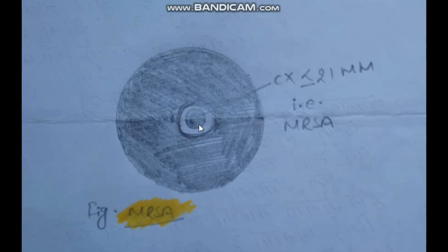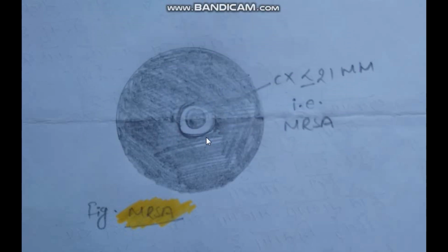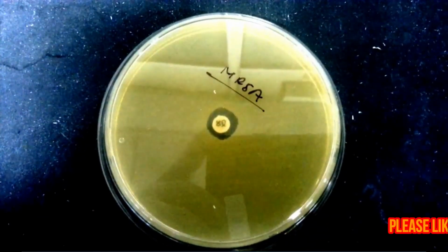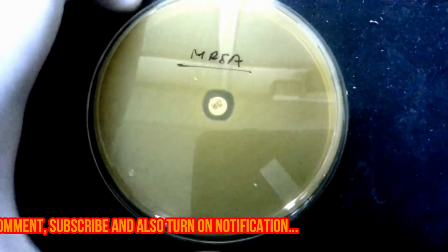After overnight incubation, if the zone of inhibition of the cefoxitin disc is less than or equal to 21 mm, that is millimeter, the organism is methicillin resistant Staphylococcus aureus. Very simple. Okay, so here you can see this is the MRSA isolate.